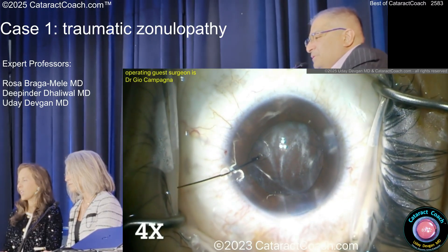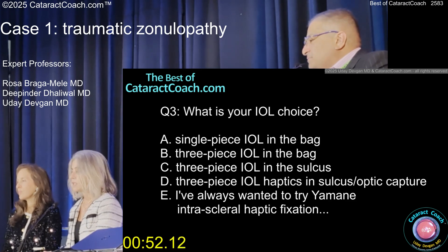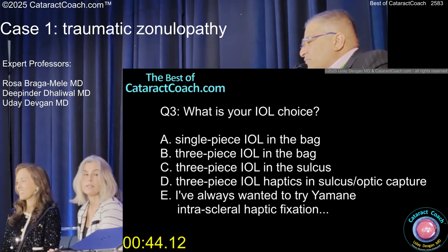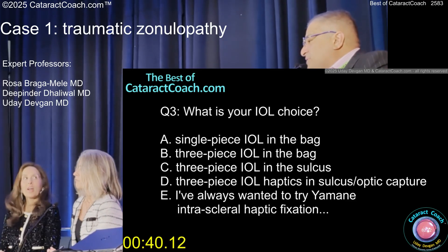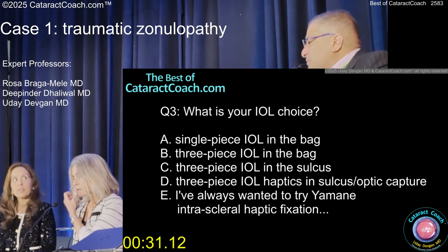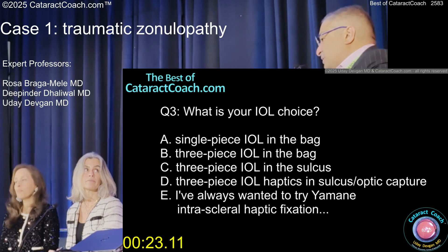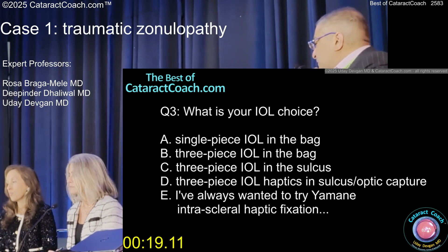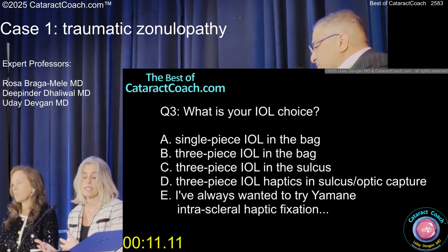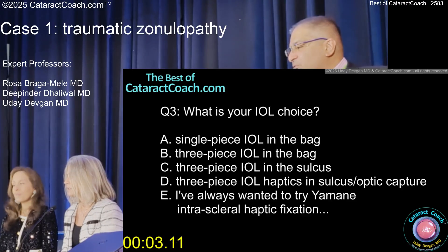What do you want for the IOL choice here? You want to put the lens in the bag — single piece, three piece? You've got an intact bag, and you put in a CTR and a capsule tension segment, so I would put a single piece in the bag. These guys like a three piece. If you were going to put a three piece, how would you put it in? Haptics in the sulcus, optic capture. Put the haptics in the sulcus, optic capture if you're going to put a three piece. Orient the haptics 90 degrees away from the area of zonular loss. And there's someone in the room who says they've always wanted to try Yamane. It looks like just a single piece in the bag looks okay.